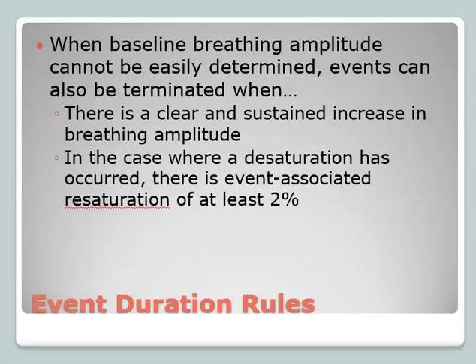When you cannot determine when the baseline breathing amplitude returns, because their breathing is wonky and all over the place, how do you know when to end scoring the respiratory event?